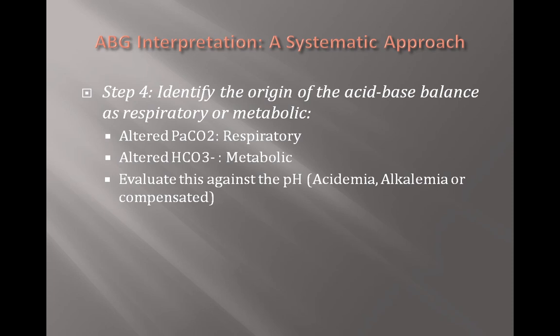One trick I found to help simplify this is to match the pH with a respiratory or metabolic parameter that correlates. So, for sake of argument, let's say you have a pH of 7.30 and a partial pressure of carbon dioxide of 70 and a bicarb of 28. The pH is acidemic, so I would match the respiratory element as it's demonstrating an acidosis, right? It's the reduction in ventilation that is a primary acid-base disturbance. The bicarb represents a mild compensatory drive, so without it, your patient would wind up with a more profound acidemia.